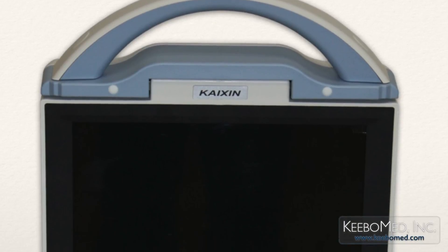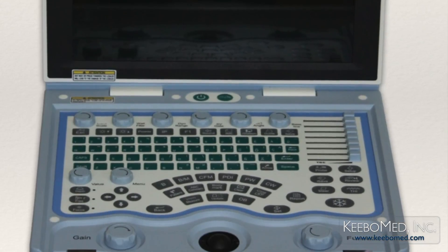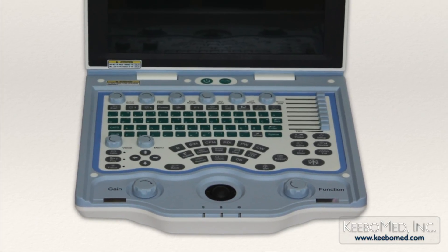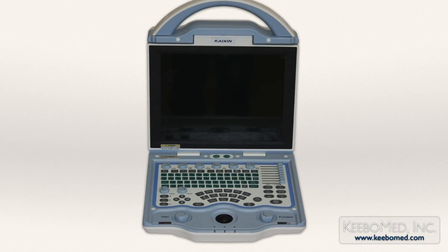The DCU-12 is a fully digital colored Doppler ultrasound that has many unique features and functions. It is easy to use, has proven to be very reliable, and is the most affordable colored Doppler ultrasound on the market today. The DCU-12 can be used for either human or veterinary use.